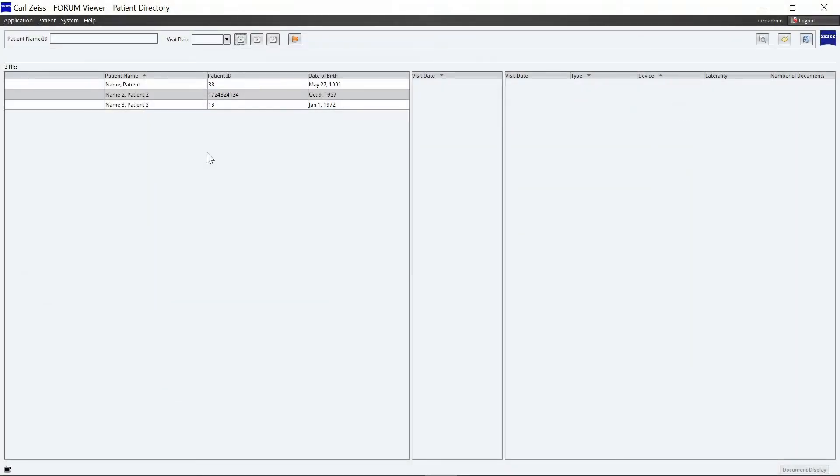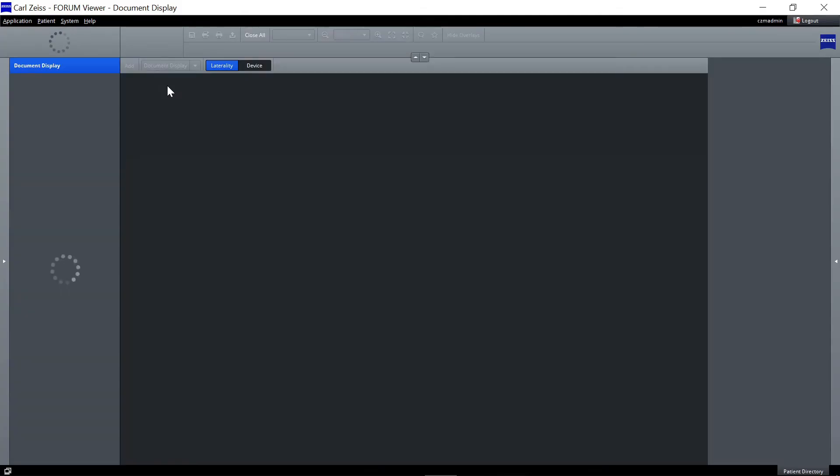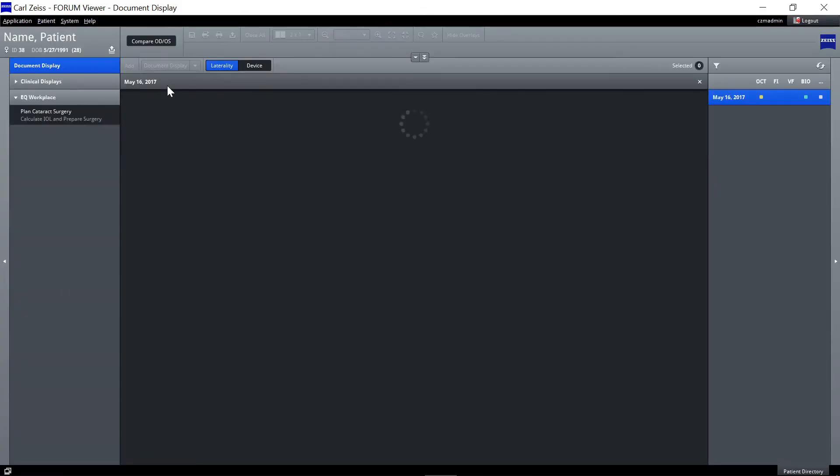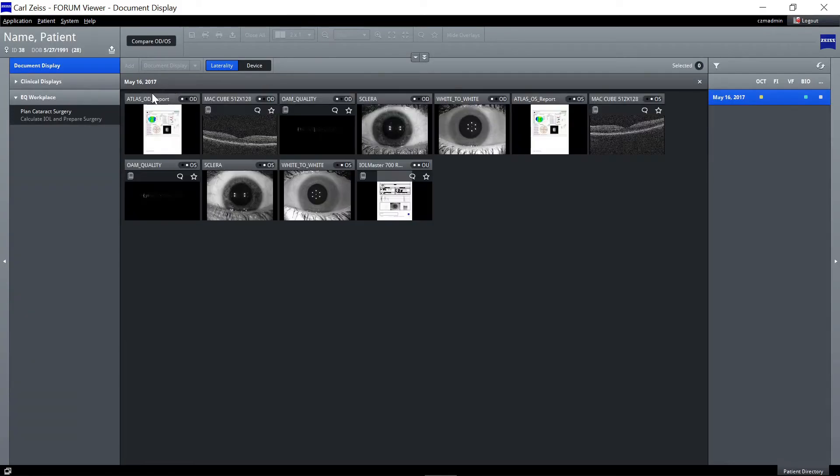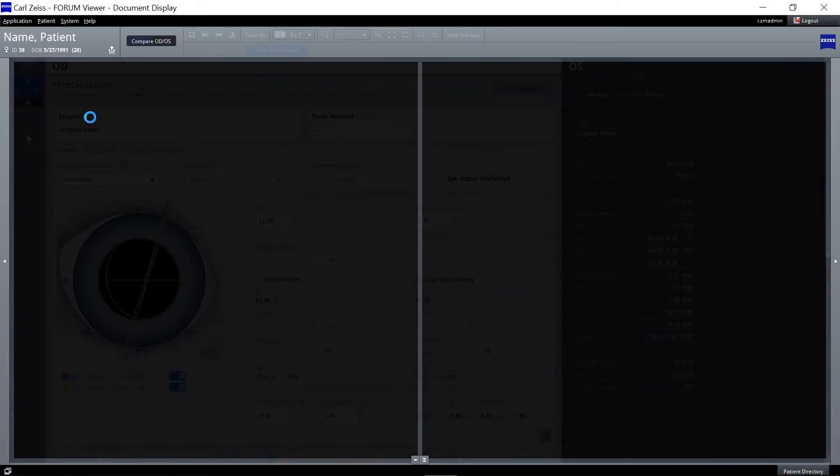In the patient directory on Zeiss Forum, select the patient by double-clicking on it. In the patient's document display, double-click on the Calculate and Prepare button to open the Zeiss EQ Workplace plugin.